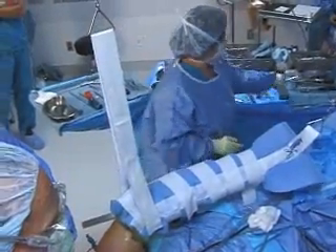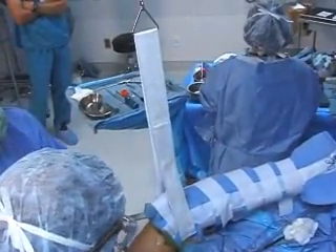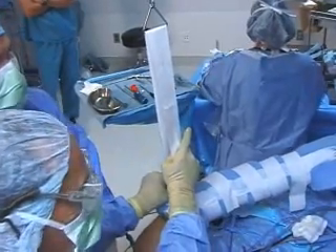For open and arthroscopic rotator cuff repair it is sometimes an advantage to have rotational control while repairing the supraspinatus to the greater tuberosity. I think it's important to have a three-point system because sooner or later you'll be in a situation where you'll need it. The two-point system is necessary for instability surgery when using lateral traction, and the third point — the traveling pulley — is necessary for viewing in the bursa when the scope is in the lateral portal looking at a rotator cuff tear over the tuberosity, which is literally impossible to see and instrument without moving the arm into that position. Any surgeon sincerely interested in doing shoulder arthroscopy should give it a look.